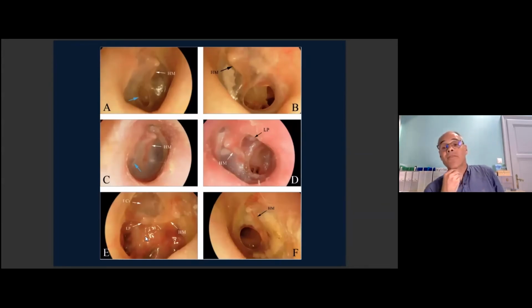In a very heavy dysfunction of the auditory tube, we can find such tympanic membranes. You can find a myringosclerotic area in the pars tensa, but here, an atrophic area, in case of acute infection, in this area can develop perforation. This is the same patient, right side and left side. And a similar situation can be found in this case.